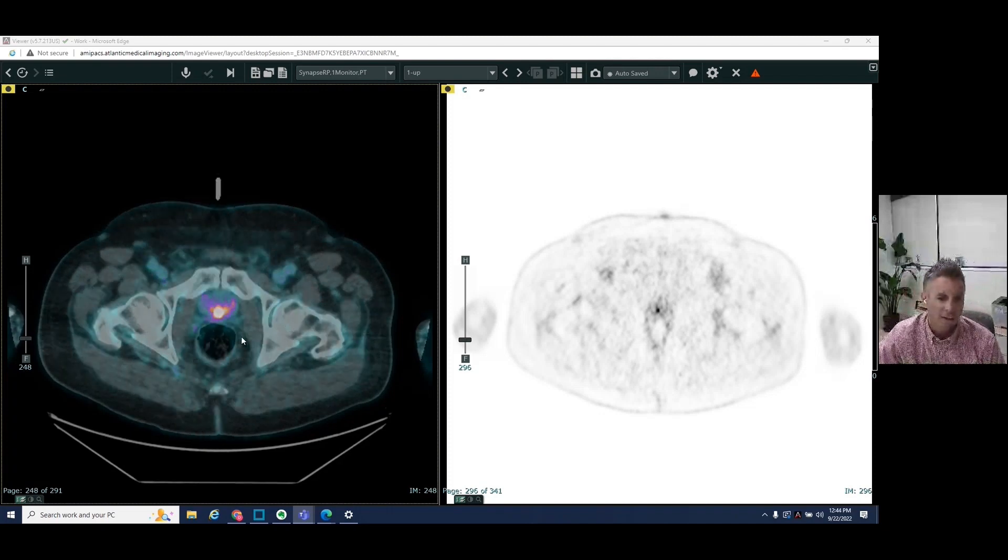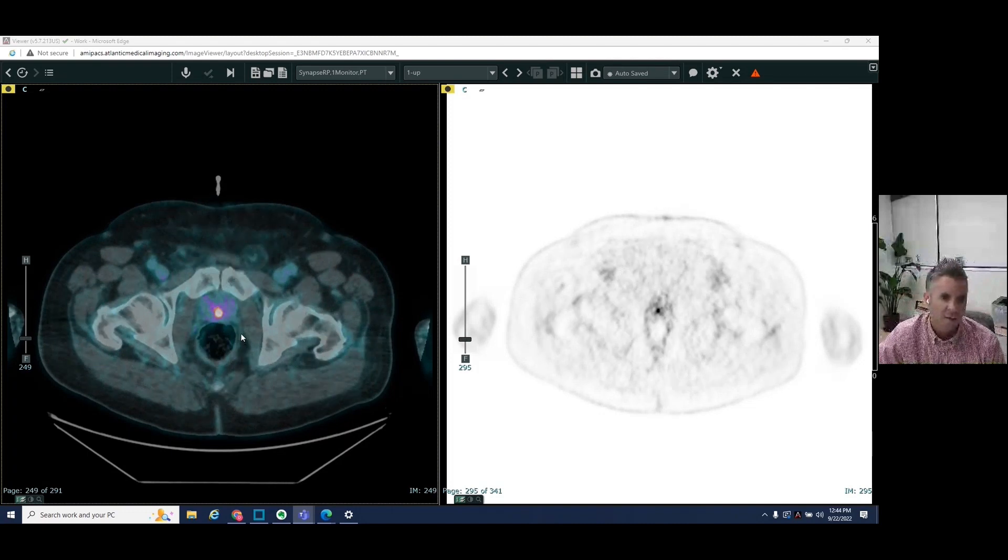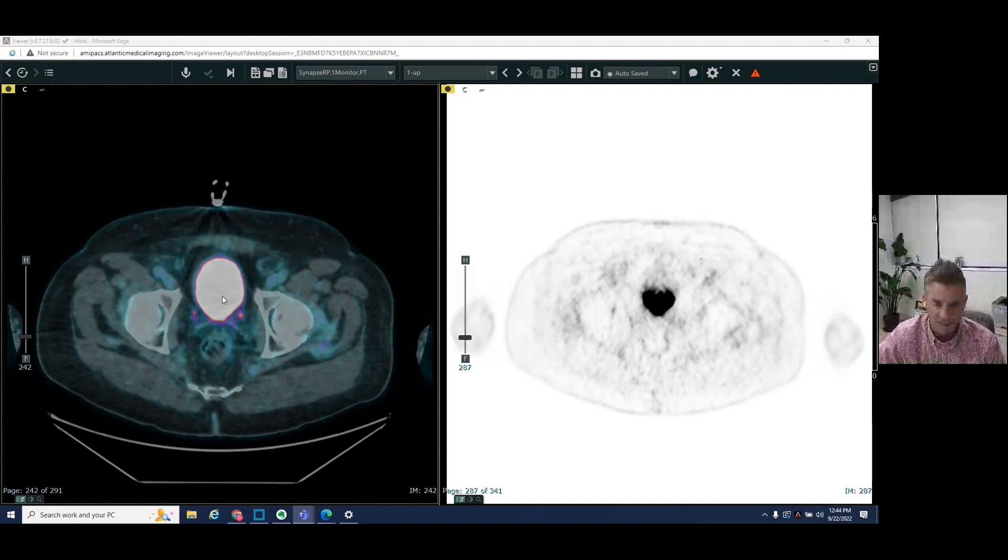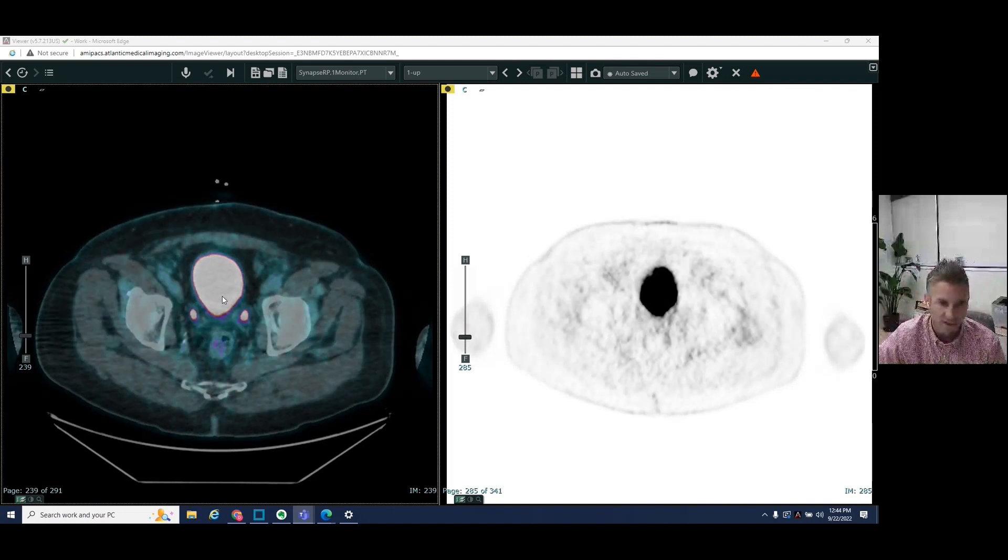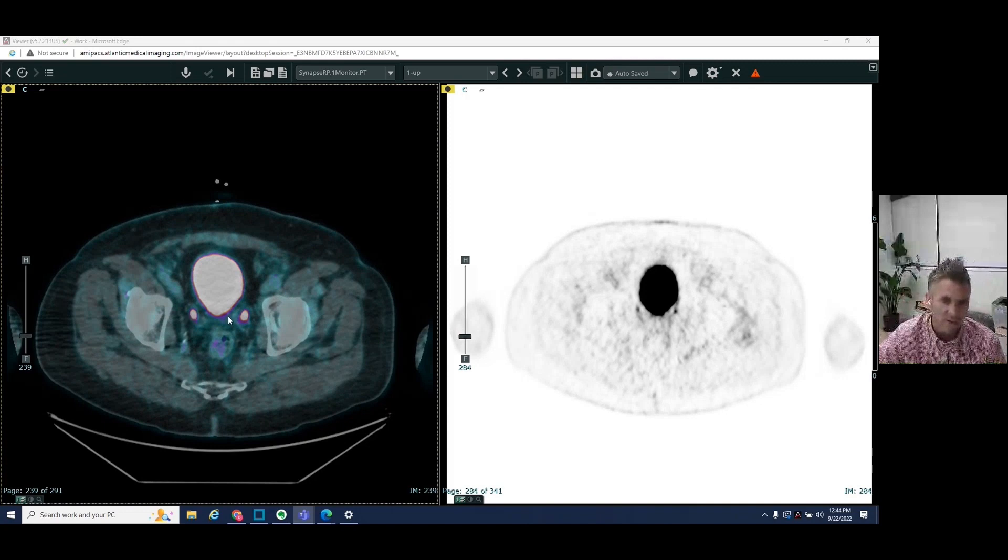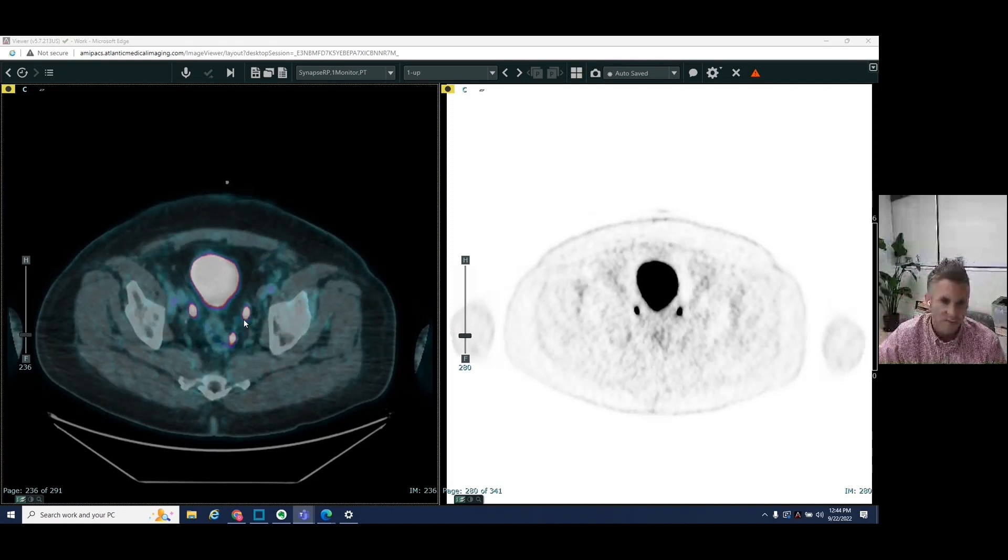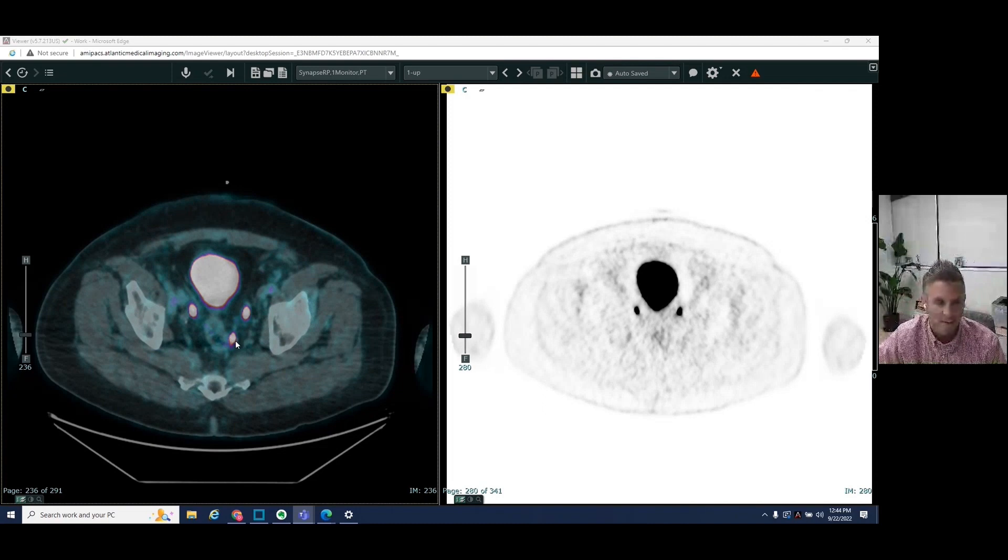And first area that we see here is the bladder. This is normal, just normal physiologic excretion of this tracer agent. So that's okay. We see the ureters here. Again, that's normal, and that's okay. However, we see this area which is hot at the left aspect of the rectum.